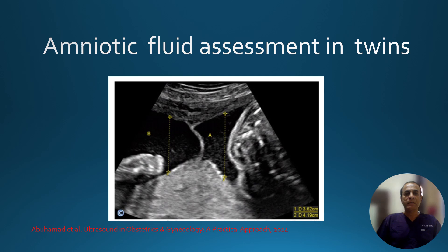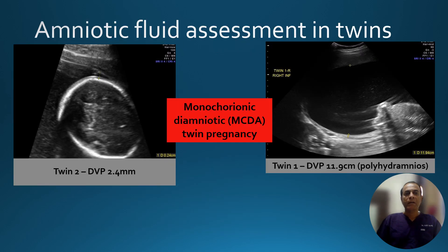This is an example showing a differential in deepest vertical pocket measurement in a twin gestation. This is also a marker of early twin-to-twin transfusion syndrome. For example, in a monochorionic pregnancy, if the deepest vertical pocket on one side is less than 2 centimeters and the other has more than 8 centimeters, this is an early oligo-poly sequence and could be the first marker of developing twin-to-twin transfusion syndrome.